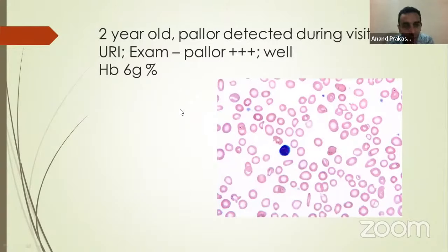So Dr. Shalini says microhypo and the diagnosis of iron deficiency. So I think most of you did get this. It's a straightforward microcytic hypochromic, very common in our country, very important to pick up clinically. Many times you don't even need a hemoglobin in a peripheral smear. But if the child is looking sick or very pale, you want a baseline so that when you treat, you can follow up the child and make sure that the child gets proper treatment. It's good to do a baseline hemoglobin, differential count and a peripheral smear, quite less expensive.